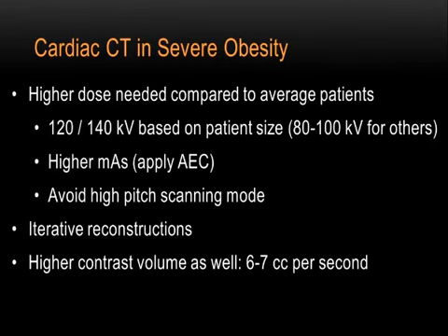Cardiac CT, again, Dr. Raff actually discussed this. You may have to increase your kV. You may have to apply iterative reconstructions.